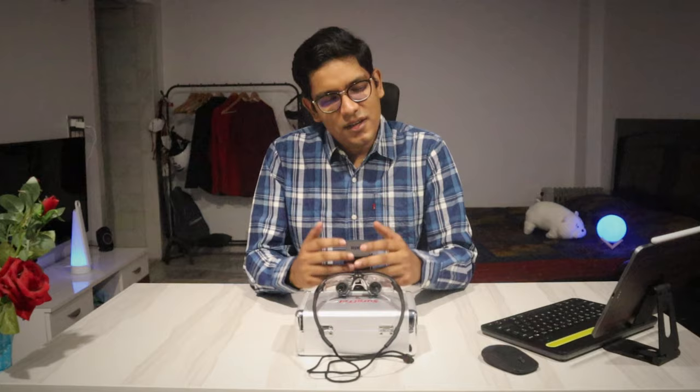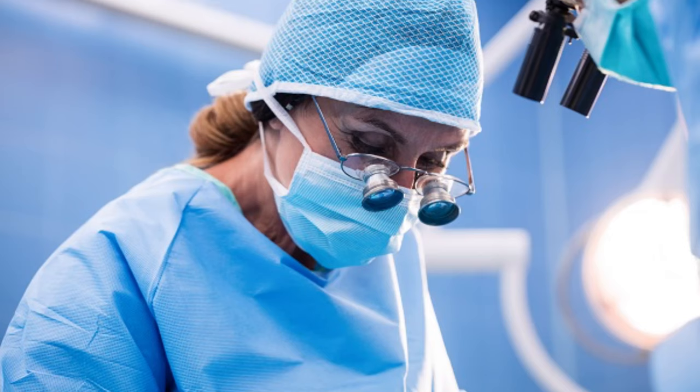Hey everyone, welcome back to The Tech Doctor, and this is a very special video. Of all the years of hard work that is required to become a surgeon, there are some moments that make the journey memorable and worthwhile. And today is one such moment. Today I have bought my first surgical loop.